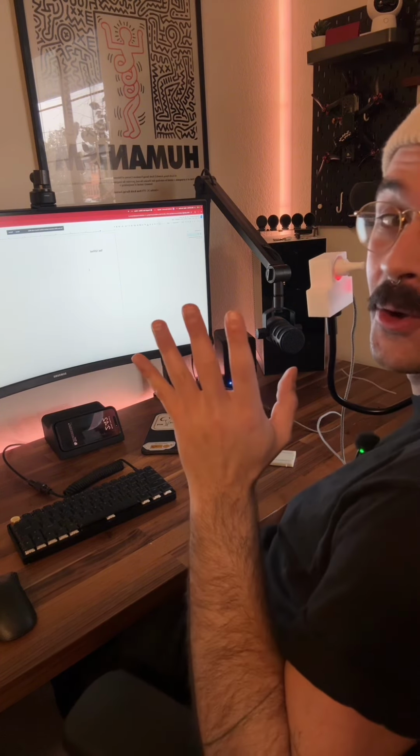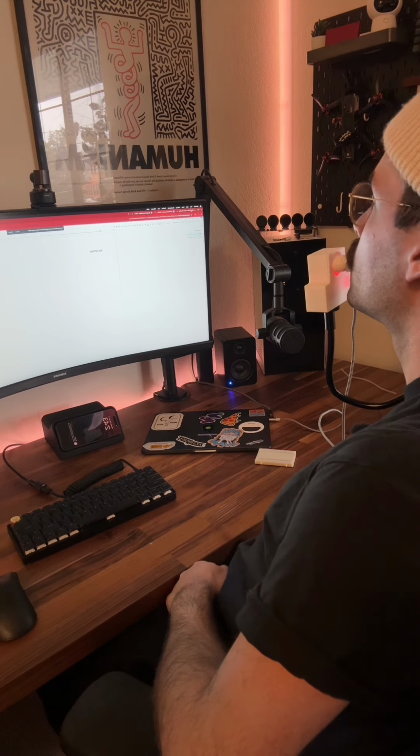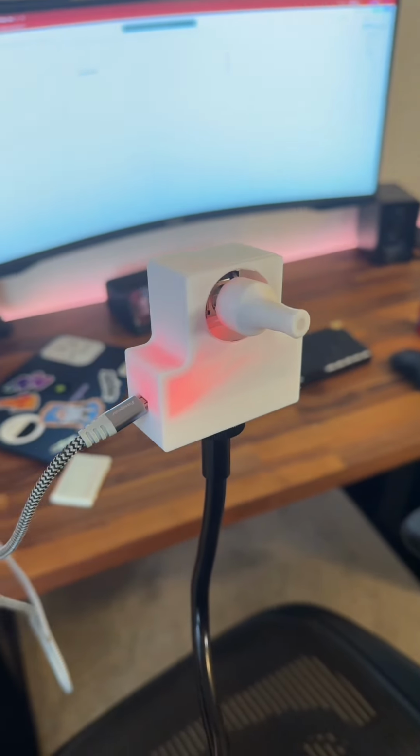That is so cool. And honestly, very easy to use. Even like browsing TikTok and stuff. I'm really happy with how this turned out. Total cost to build this was about $30. Lots of room for improvement, but I'm really happy with how this thing turned out. I hope this inspired you to do something good today.